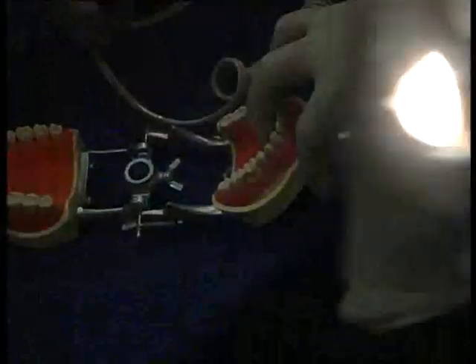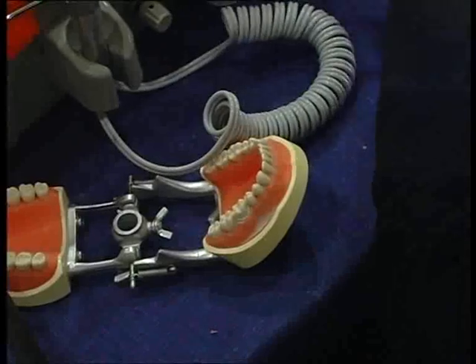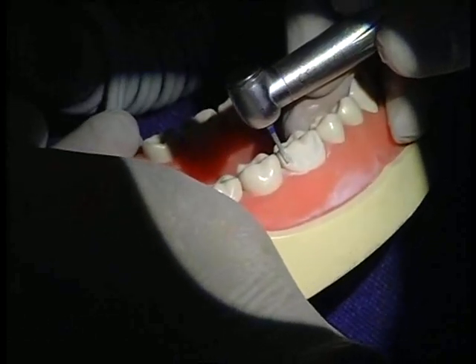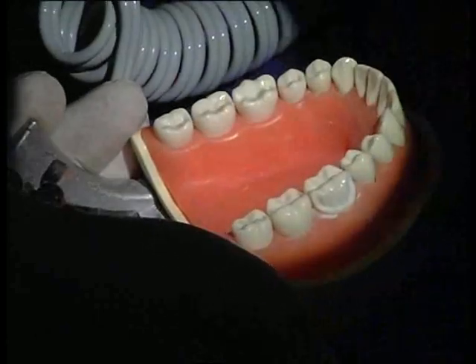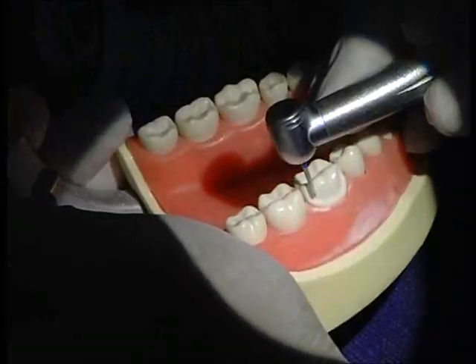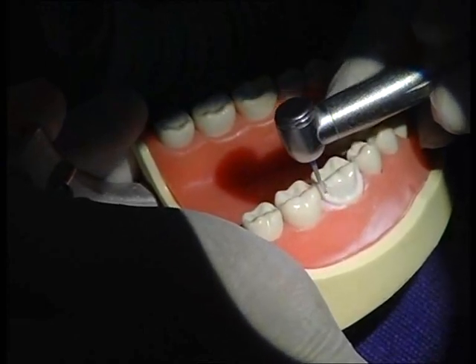Once I have confidence in how I'm doing this I could keep it directly equi-gingival. At this point I'm keeping it supra-gingival so that you can appreciate it — in a patient's mouth this should be equi-gingival. Next burr is the interproximal burr. This is the gingival crest; I will slide slightly above it and simply run through. Again, no change in direction — this should stay constant and straight because the taper is already incorporated into your burr.